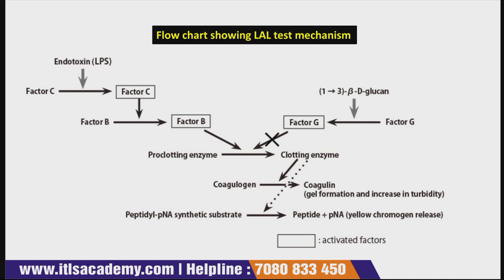As you can see in this figure, there is an outline of the coagulation of endotoxins and beta-1,3-glucan in Limulus lysate. This Limulus lysate contains a specific recognition protein for bacterial endotoxin, that is factor C. Factor C is a specific recognition protein for bacterial endotoxins.